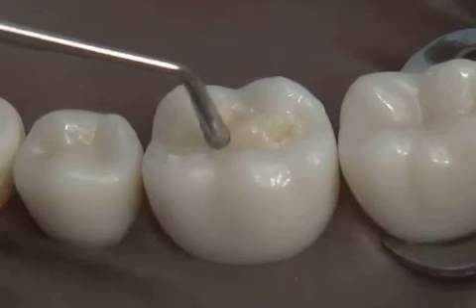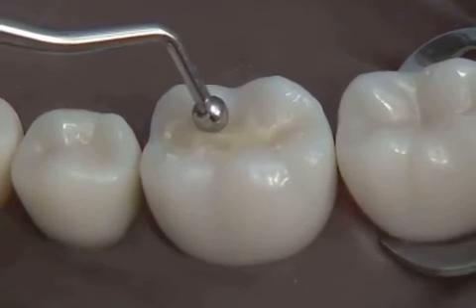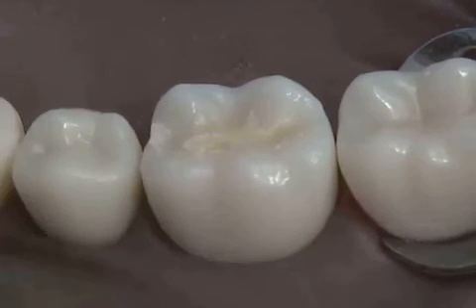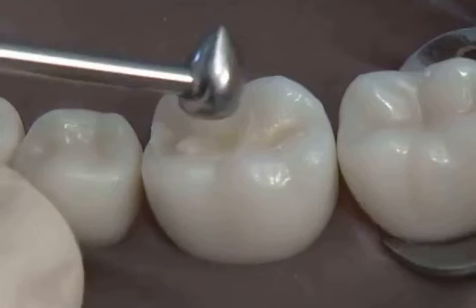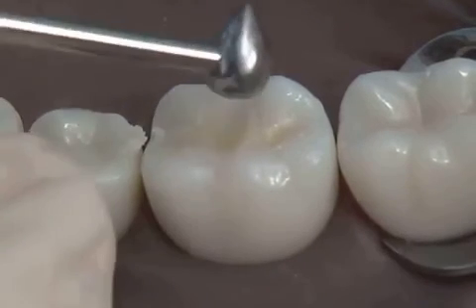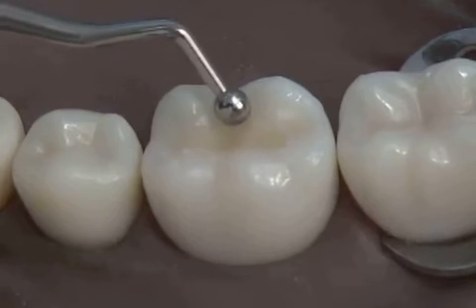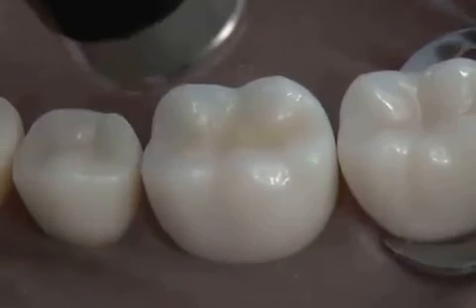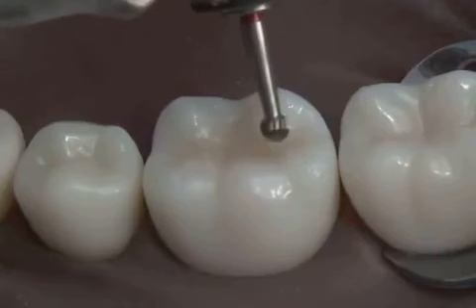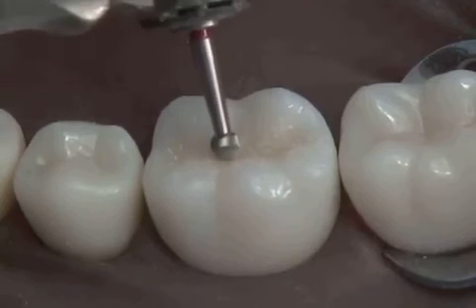At this stage, we can pack the composite, but also contour it with a ball burnisher, swiping along the cavosurface margin to remove excessive composite material and shape the composite to restore natural anatomy. You can contour the composite further with a round or football finishing burr to recreate the natural depressions and fossa of a posterior occlusal surface.